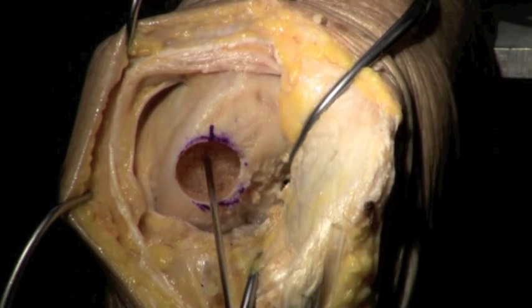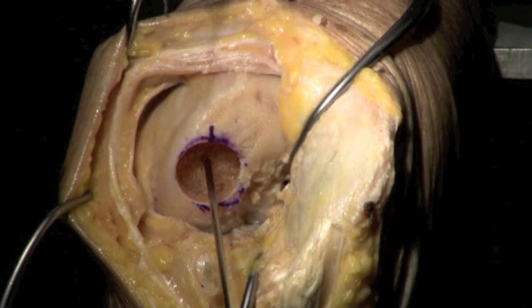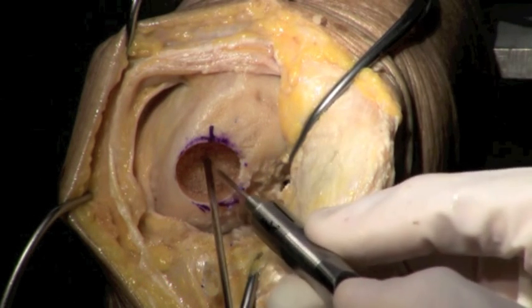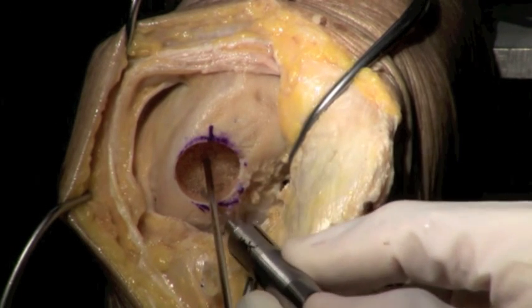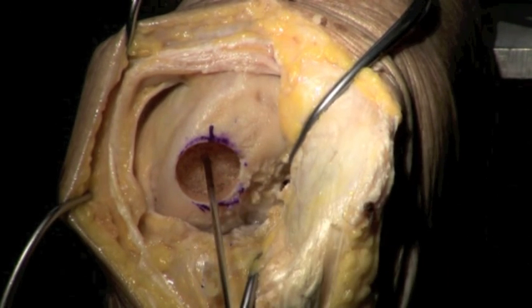All right, for all you woodworkers out there who have actual interest in the details here, we want to make sure that we measure the depths at all four quadrants of our defect so that we can tailor those to fit the graft, so the graft isn't proud in one area and recessed in another area where it might see different asymmetrical loads.